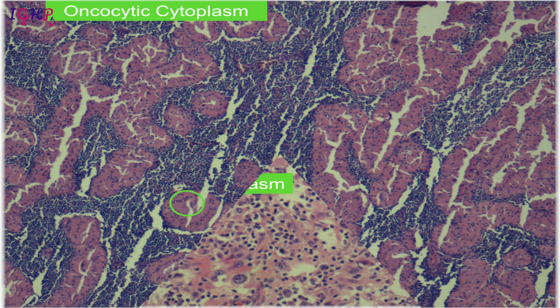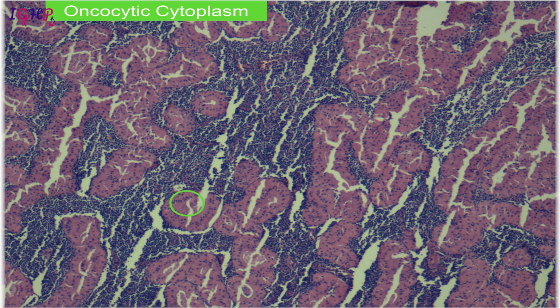Like this is another tumor in which you see that the cytoplasm of these cells is abundant, and this abundant cytoplasmic nature makes them called oncocytic cells. So that is another type of cell that we see, in which you have abundant eosinophilic cytoplasm, not as granular as we have seen in the endocrine organs. And this cytoplasm which is eosinophilic, as opposed to the cells seen in the background, which have a bluish cytoplasm. So these are basophilic, as opposed to this which is showing an abundant eosinophilic cytoplasm which is well defined.